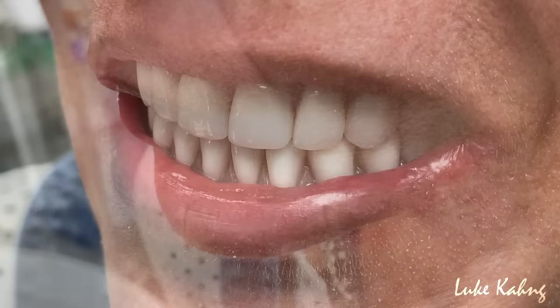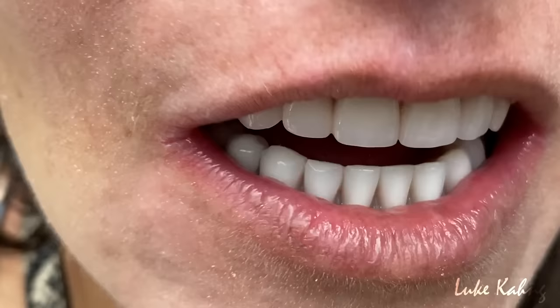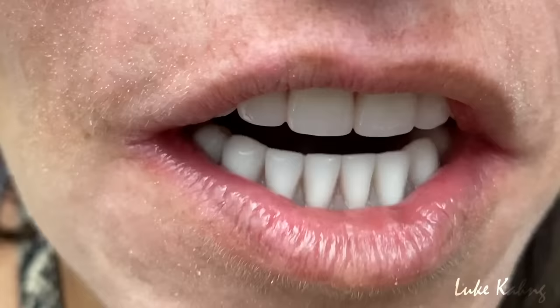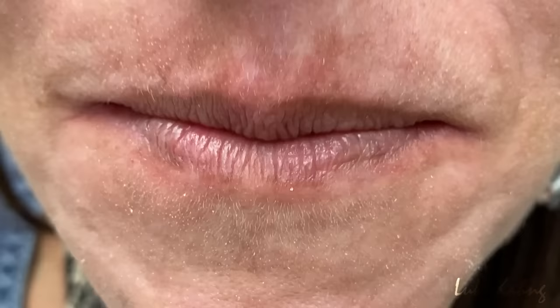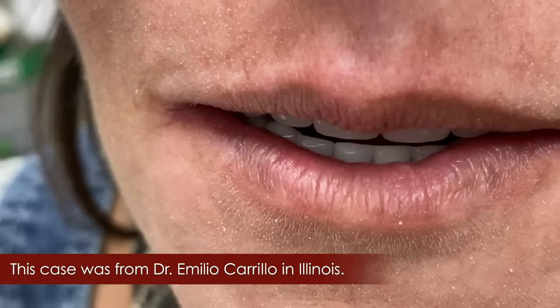All right, the try-in top and bottom is the bleaching color. And how many minutes to get it done? One hour and 20 minutes. Don't tell us we finish same day, right? It pronounces the S sound. S. I'm going to say something, or like F. F? Nice, it's a big smile.